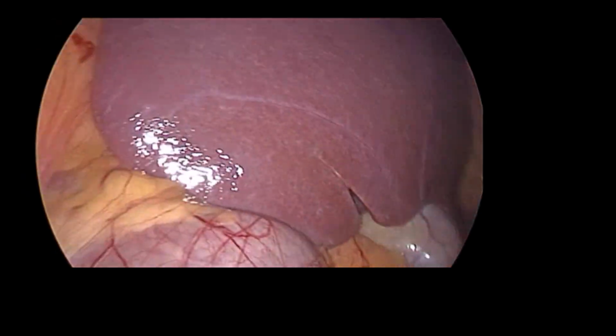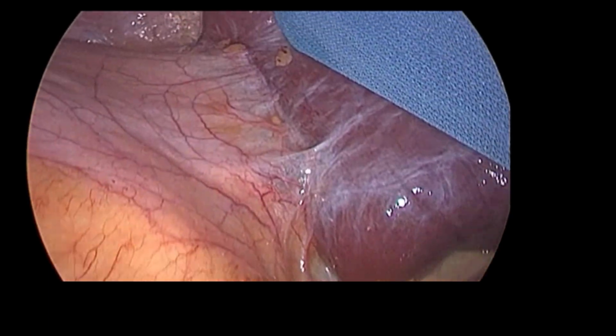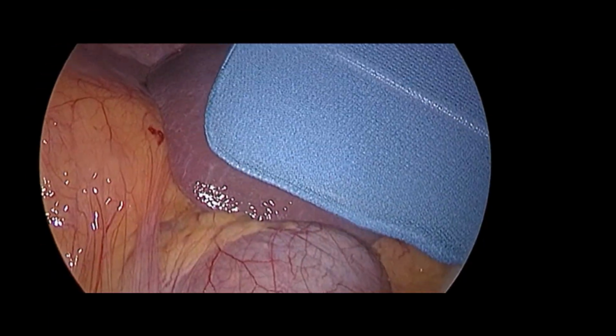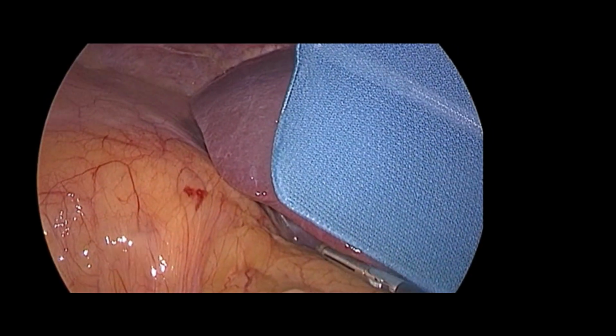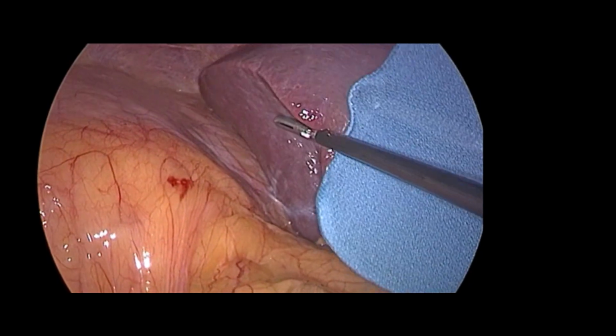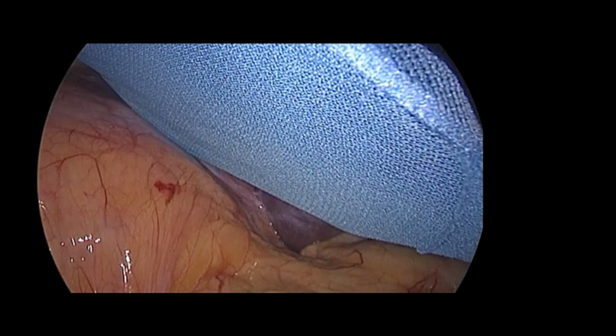Here's the paddle retractor. In this video clip, the surgeon has already fully deployed it as they maneuver around the liver, and ultimately they get excellent retraction as we saw earlier. I actually prefer to leave it undeployed as I bring it in, get it in position on the liver or the spleen, and then deploy it to the extent I need it. You don't have to have it completely deployed. It allows for directing pressure in smaller areas when necessary.